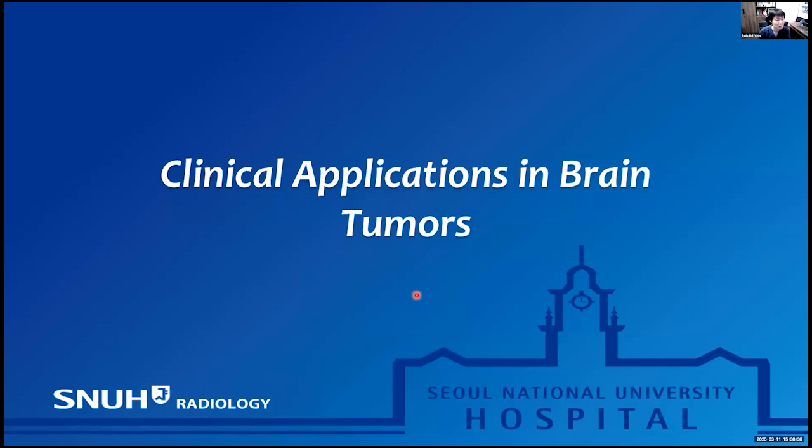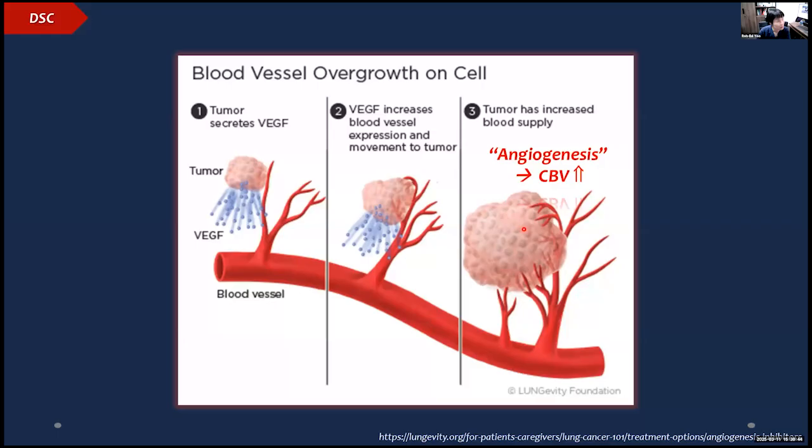Now, in the second two-thirds of the talk, I'll be dealing with some clinical applications of the three perfusion-weighted imaging techniques in brain tumors. Before we go into the clinical application of DSC, let's take a brief look at how blood vessels overgrow in tumor cells.